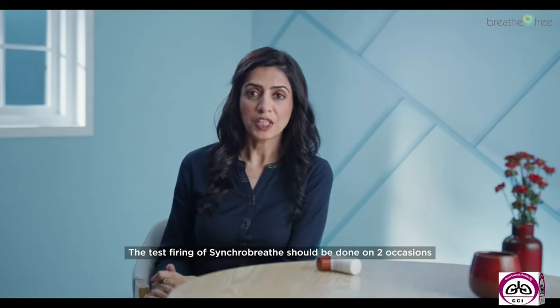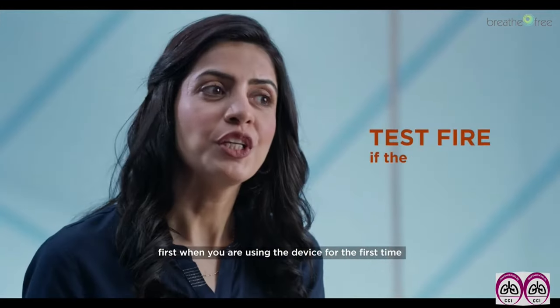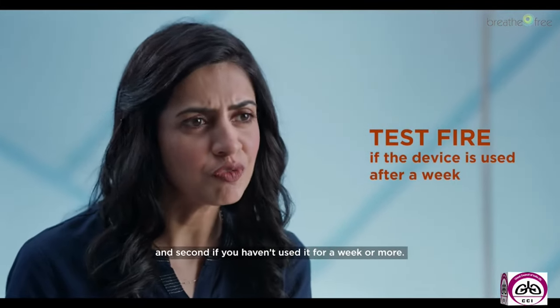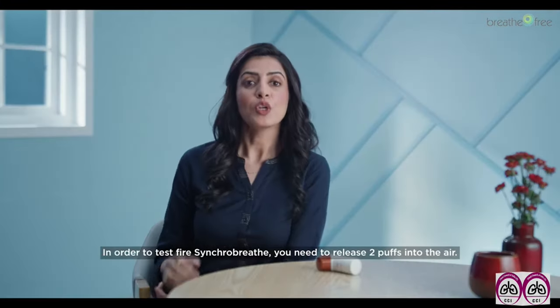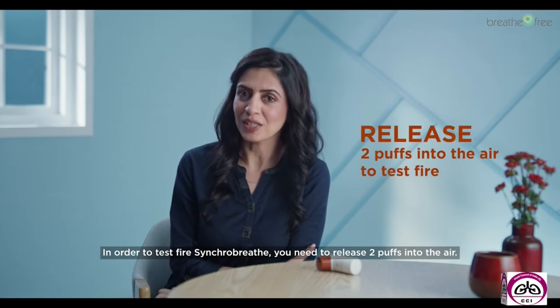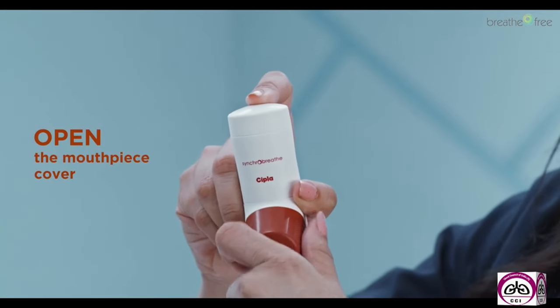The test firing of SynchroBreathe should be done on 2 occasions. First, when you're using the device for the first time, and second, if you haven't used it for a week or more. In order to test fire SynchroBreathe, you need to release 2 puffs into the air. First, shake the inhaler and open the mouthpiece cover.